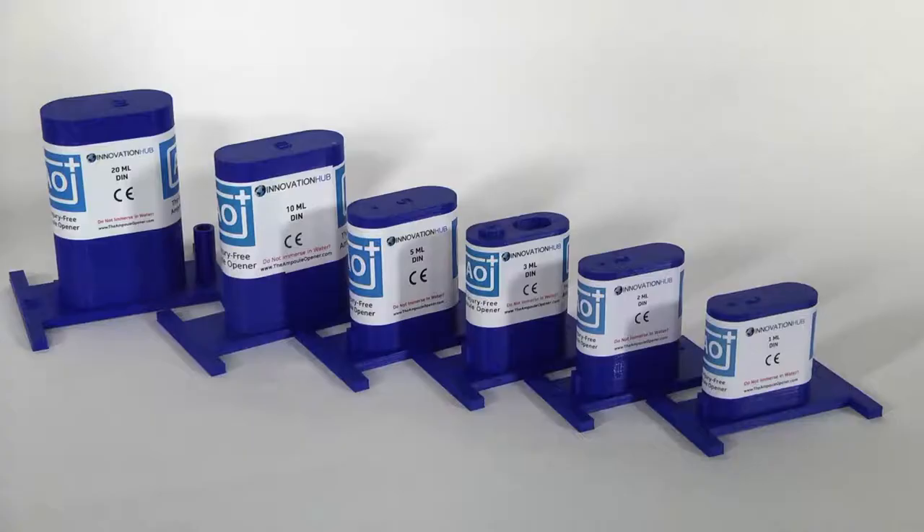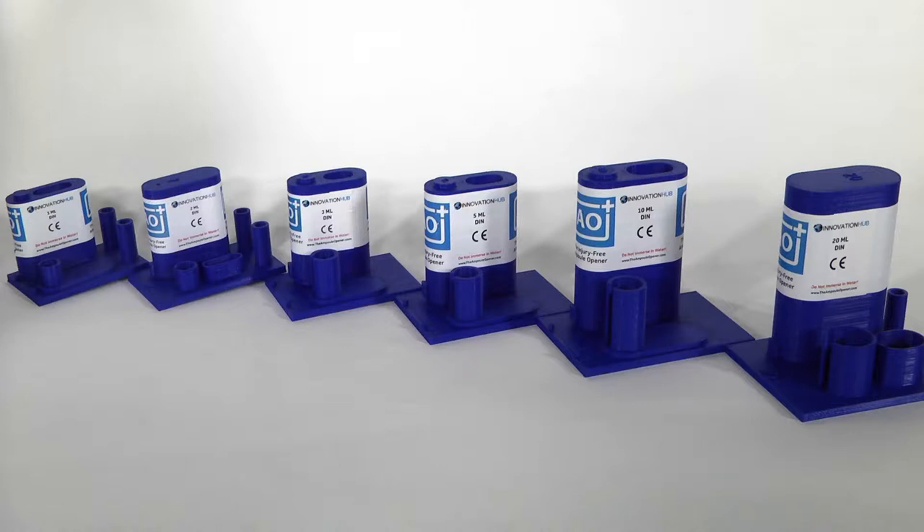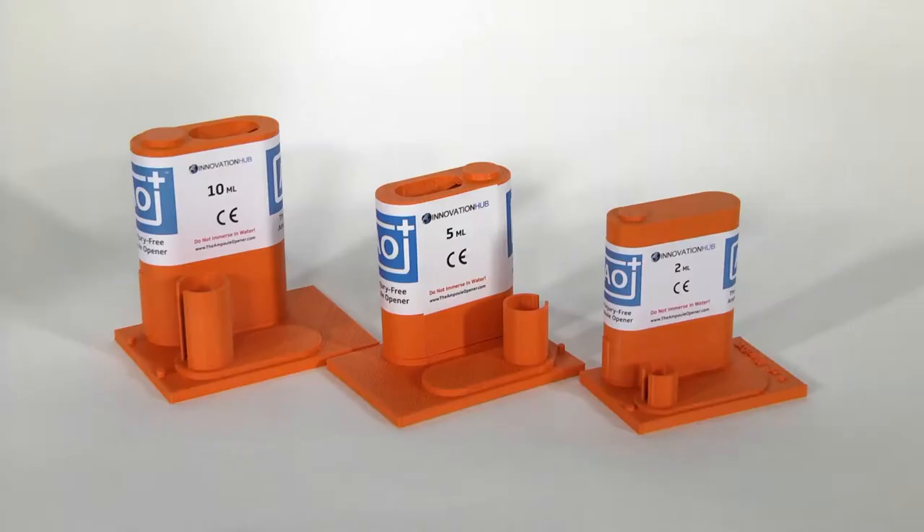These models of AO Plus are the DIN ISO 9187 range — European and USA sizing. These models range in sizes from 1mm up to 20mm. These are for unidirectional opening ampules, the ones with the dot on the neck. These orange units are designed to open Wheaton ampules, made in the USA.